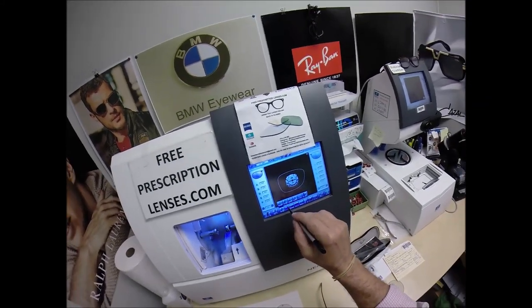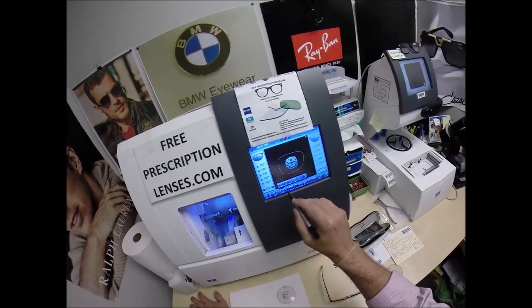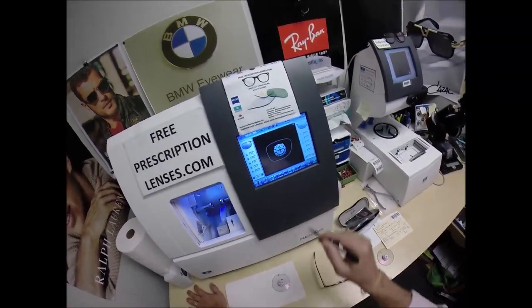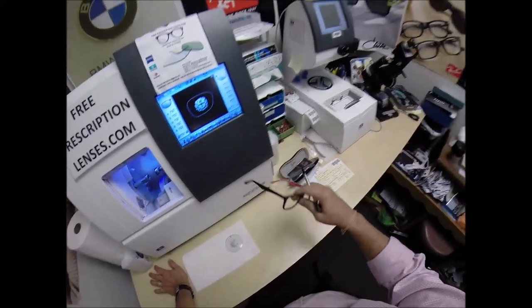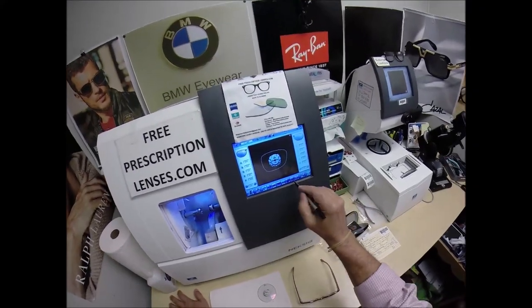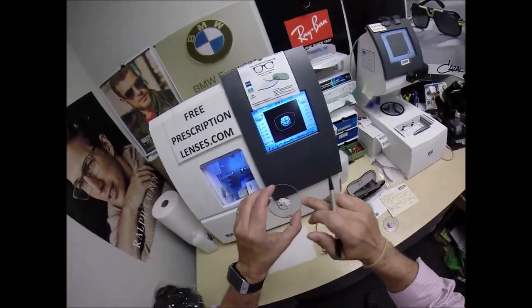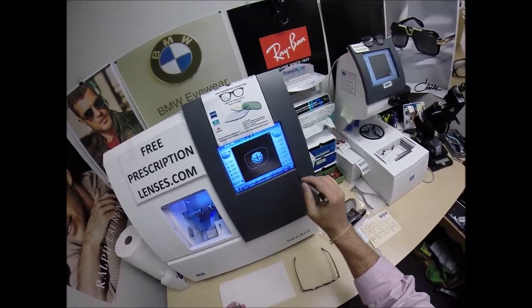These are polycarbonate lenses. If they were plastic, high-index plastic, or Trivex, we would select that material — those are just different lens materials. But I'm going to stick with polycarbonate because it's my lens material of choice, and I'll explain why later. I'm not going to put a polish on the edge of the lens because it's not going to be seen in this frame. I'm not going to put a safety bevel on the front convex surface of the lens, but I am going to place one on the rear concave surface.